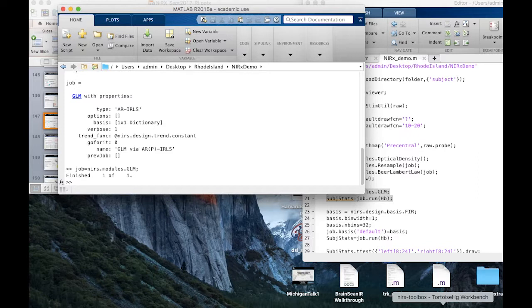They're outliers. And so you can use statistical methods, robust regression specifically, that deals with outliers. That's a statistical model that is less sensitive to having outliers in the data. We do that, and especially if you auto-regressively filter, those artifacts just appear as if there was one point in time where you have so much more noise, for both shifts and spikes types of artifacts.